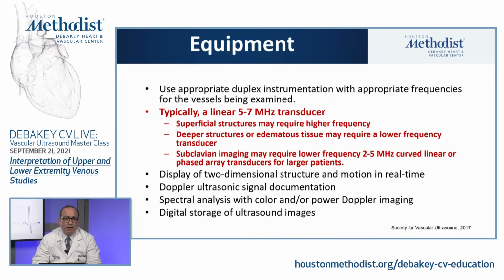If you're looking at the more superficial veins, such as the basilic or more likely the cephalic vein, especially in somebody who is very thin, we may want to consider a higher frequency transducer, 10, 12, up to 15 megahertz, to look at the more superficial structures.